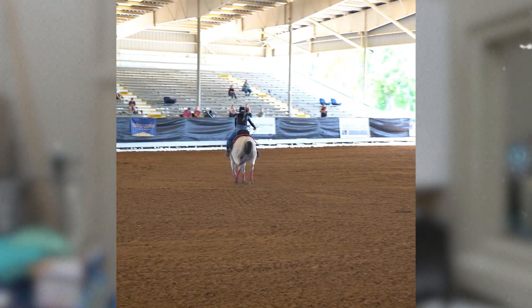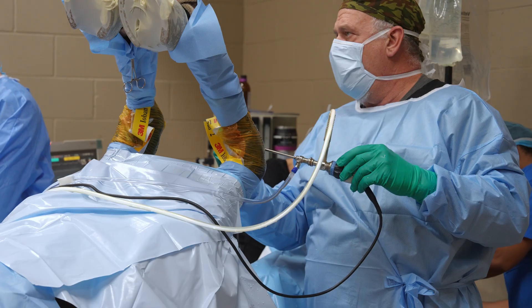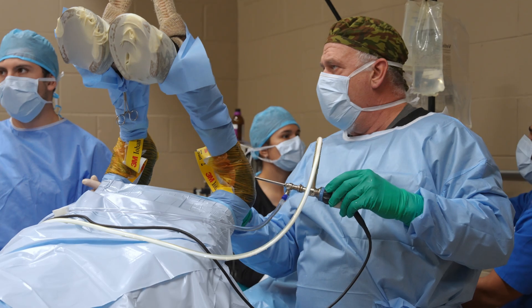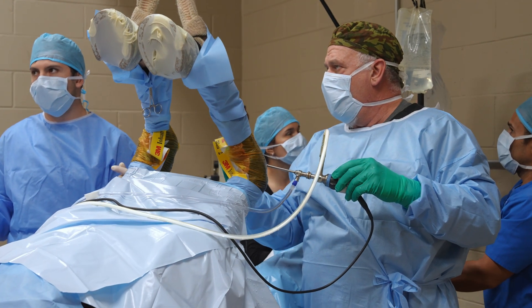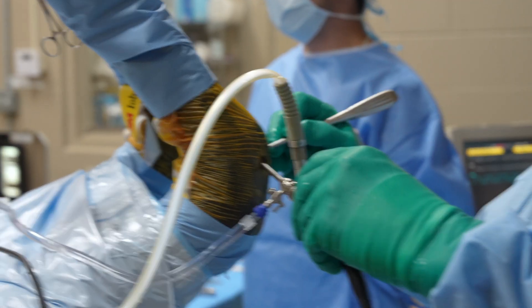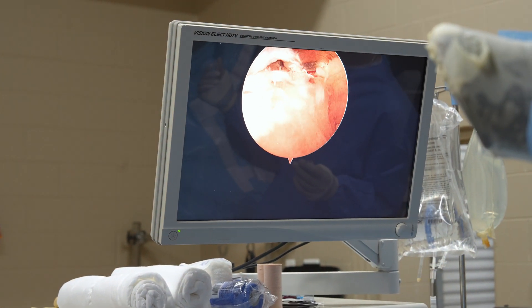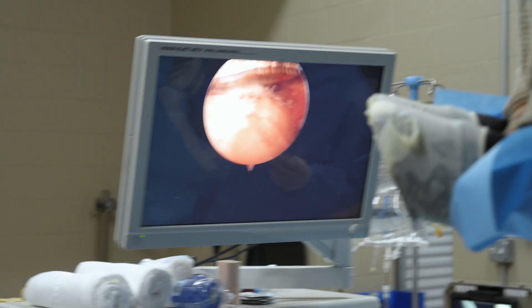You can see in the surgery how the surgeon is going in with an instrument and taking that fragment — it's like a plier, literally taking that fragment. He's looking at it with a high-definition camera going into the joint and actually removing it.